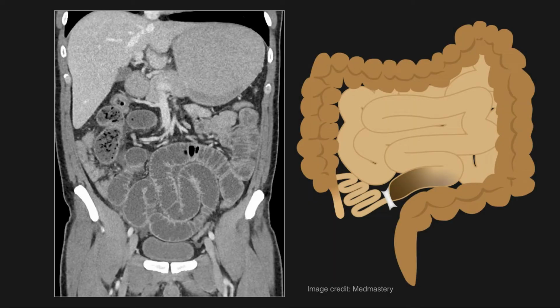CT of complex small bowel obstructions. As we journey into more complex or challenging cases in this talk, let's take a moment and appreciate the features of a more straightforward single point obstruction.